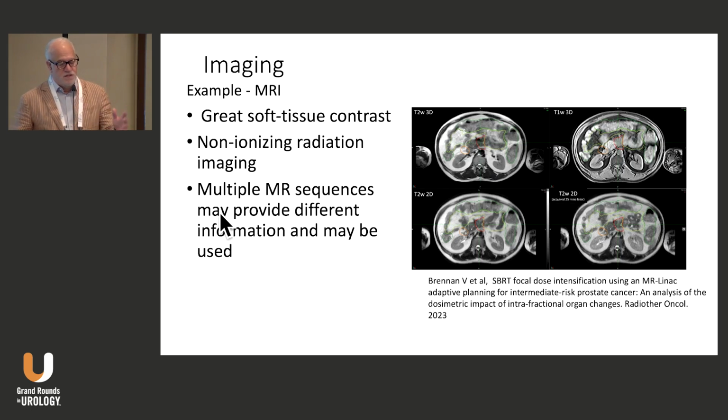So this is just showing some MR images. What's good about MR? It has great soft tissue contrast. It's non-ionizing radiation. So if you're doing cone beam CT scans like we do now, the patient is getting ionizing radiation every day, if you're using that on a daily basis.